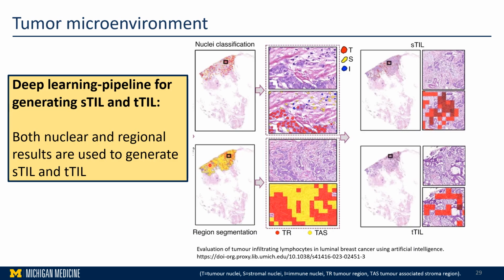Research on the tumor microenvironment has been steadily expanding, transitioning from qualitative assessment to quantitative analysis. Tools that detect tumor-infiltrating lymphocytes are essential in counting TILs and determining their locations both within and surrounding the tumor. These modules are robust enough right now to operate in real time under suitable computational conditions, of course, and handle multiple tasks simultaneously as the pathologist examines the image.